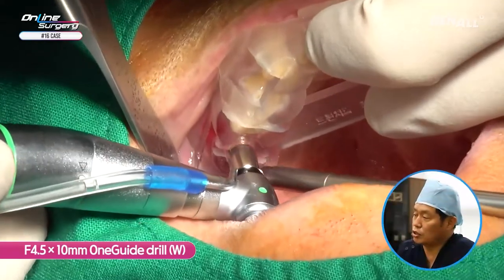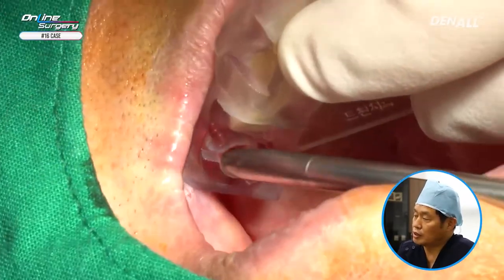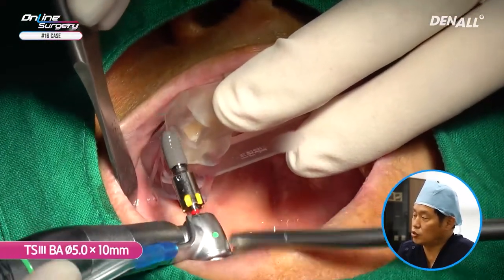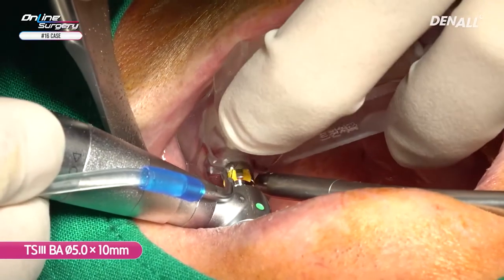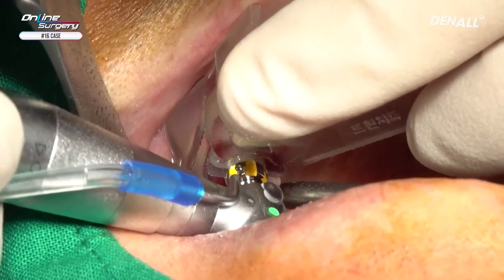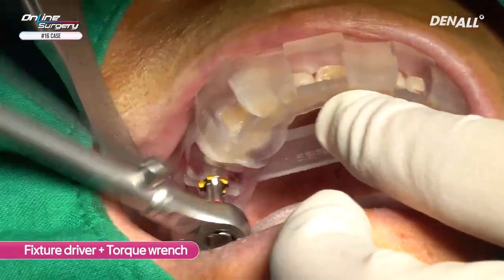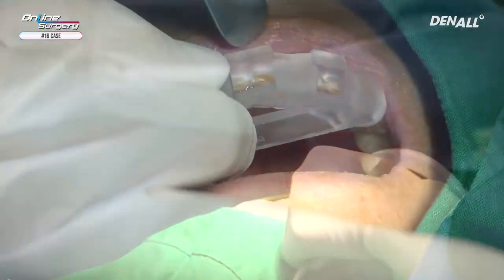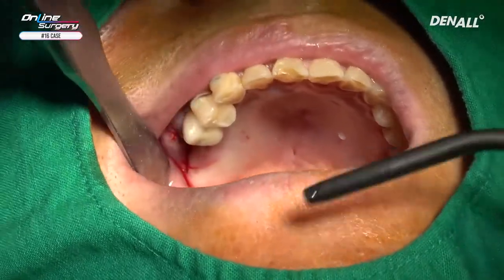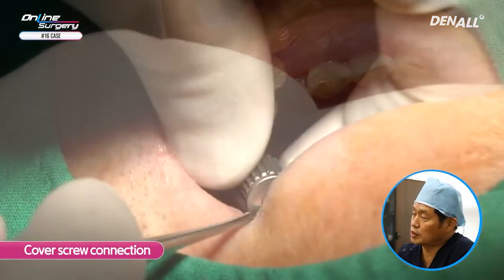4.5x10 mm drilling is done. Bone quality is not very good. TS3 5.0x10 mm is going to be placed, and the final drill is done up to 4.5x10 mm. Fixture installation is then carried out. Bone quality was not very good. Cover screw is connected.